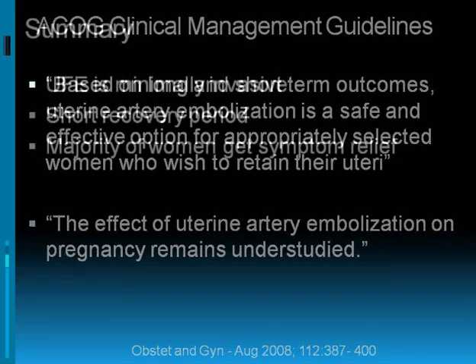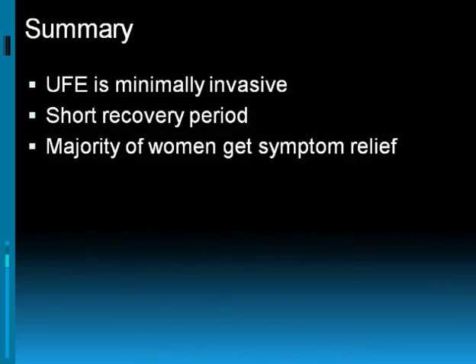So in summary, uterine fibroid embolization is a minimally invasive procedure. It's not surgery. The recovery period is much shorter than what you would have if you had a hysterectomy. And 85% of women will get either complete or very significant relief of their symptoms from this procedure.